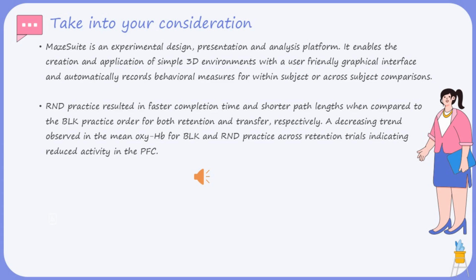MazeSuite is an experimental design, presentation, and analysis platform. It enables the creation and application of simple 3D environments with a user-friendly graphical interface and automatically records behavioral measures for within-subject or cross-subject comparisons.